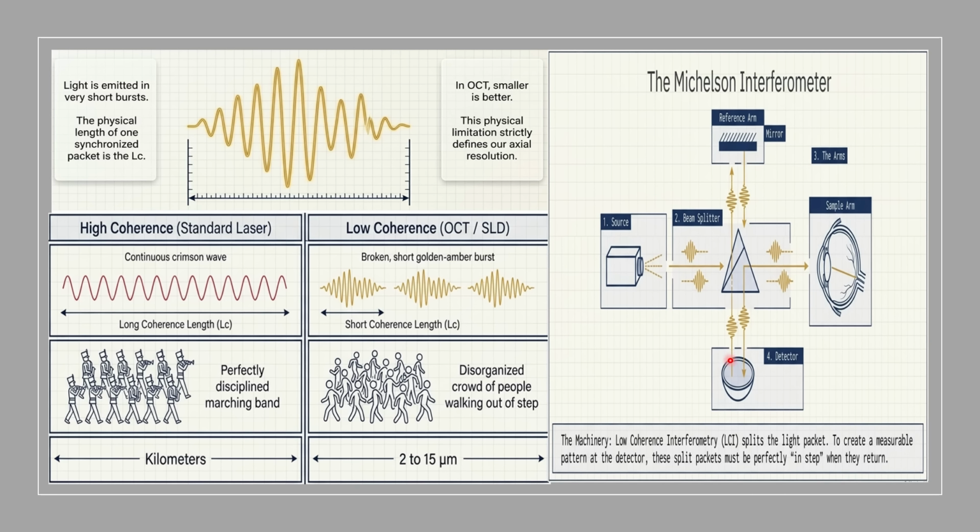Number one, if both the reflected packets of pulse from the sample arm and the reference arm are propagated in phase, in the same steps like this one, there will be constructive interference, and this will provide a high quality image.